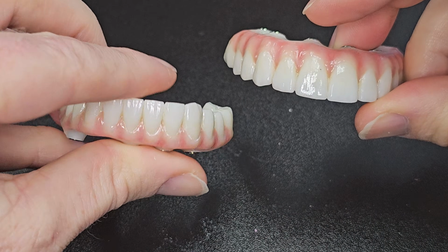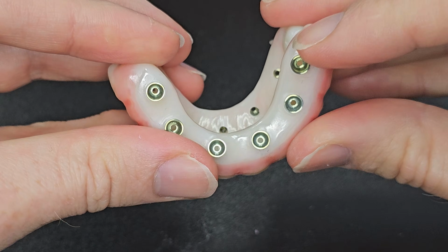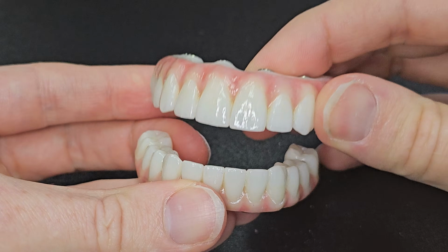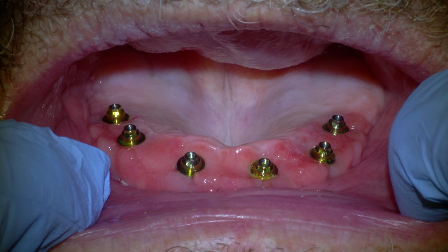And once again, there are other ways that dentists do this and other ways that I did it in the past, you just don't know how the final is going to turn out until you put it in. But since this is almost a replica of the temporary prosthesis, I know this is going to be great in every way. At the final appointment, we take out the temporary dentures and put the new ones in, and we screw them in just like before.